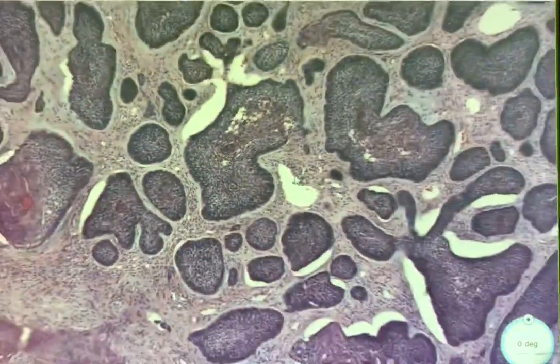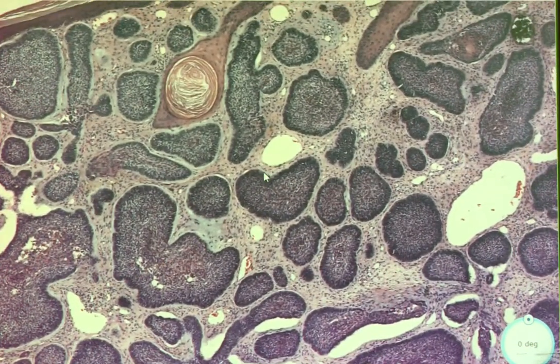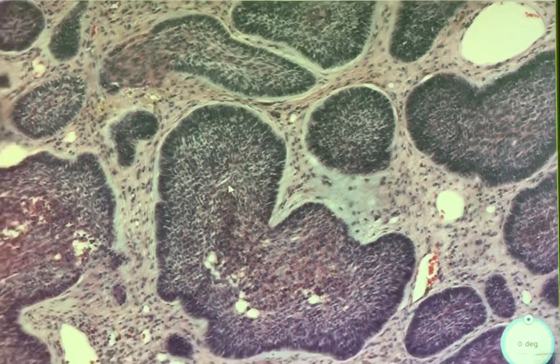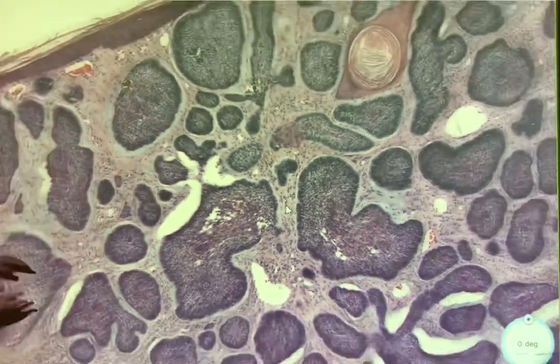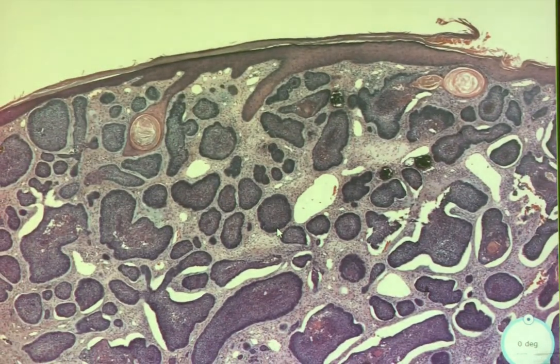What kind of basal cell carcinoma? This is where our senior can help. Yeah, please. Is it the nodular form, I think, is the term? Yes. It's like nodular infiltrating. What's the third one? I don't know. So this is predominantly nodular, because it's all these nodular type arrangements, right? Like they kind of look like balls of tumor that are just kind of everywhere. So this is nodular basal cell carcinoma. But I would have accepted just basal cell carcinoma.